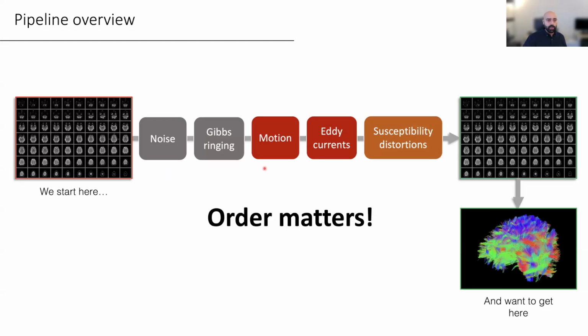Okay, so this wraps up the pre-processing pipeline and the steps that we want to cover, because this is the main thing. Again, I said there are other steps that you could apply, de-drifting and so on, but that's really a case-by-case basis. Many data sets don't require de-drifting or any other advanced forms of denoising.